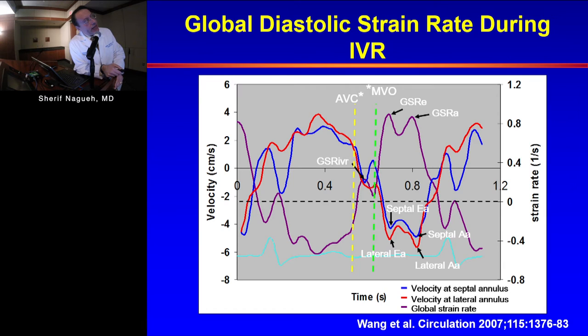So you notice early and late diastolic velocities. And for strain, we have early and late diastolic strain rate. And during the IVR, you have also diastolic velocities, and you have an IVR, isovolumic relaxation strain rate. So it is possible for us to measure these. You can measure strain rate in segments, segment by segment. So if you are interested in segmental function, say patients with coronary disease and you want to diagnose CAD, you can use that. You can also use this in the whole myocardium, in all segments that you see in each of the apical views, and then you come up with a global parameter.